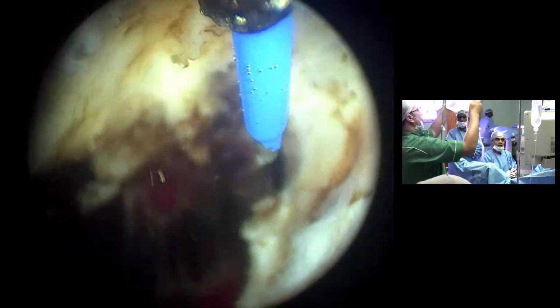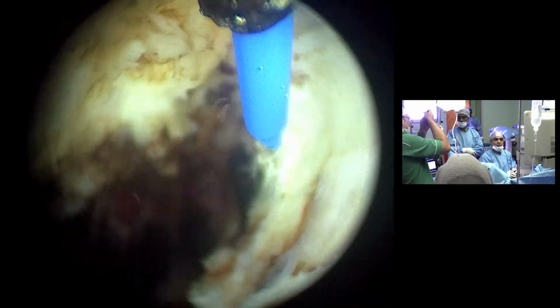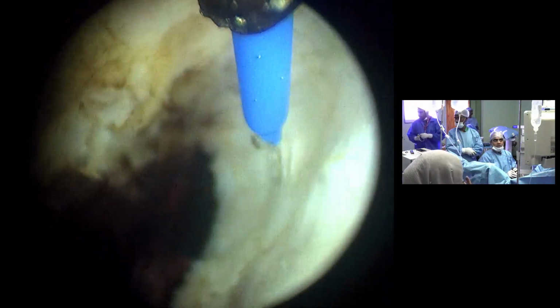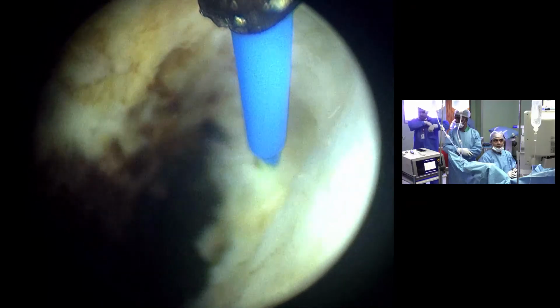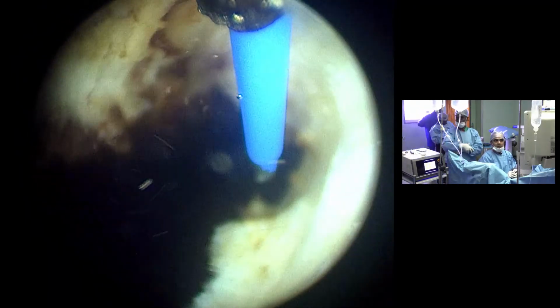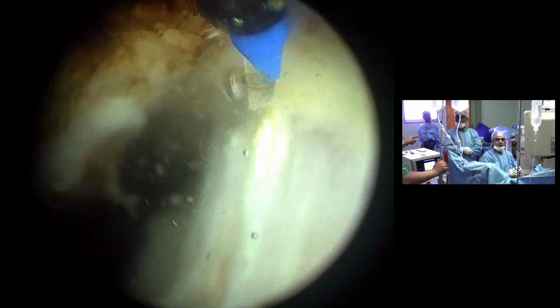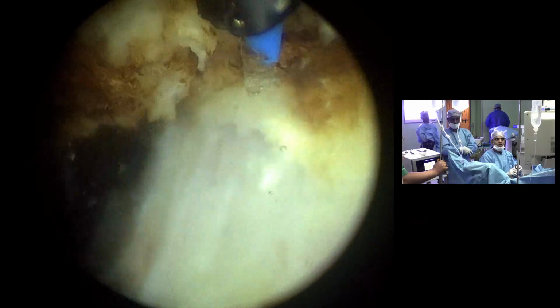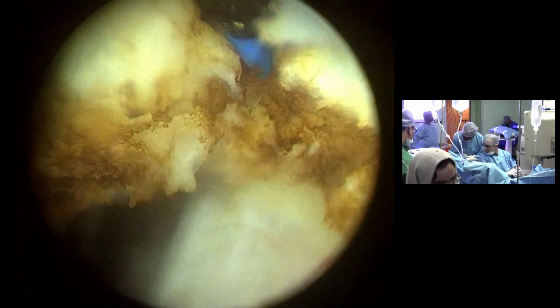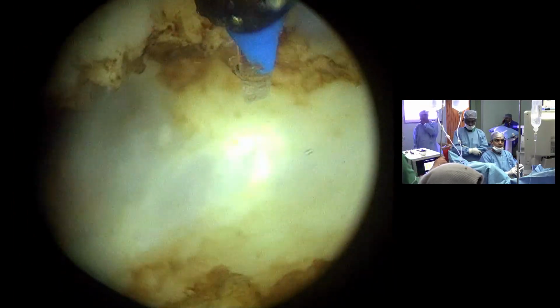The other thing is the irrigation. Sometimes people are too engrossed in the surgery, so they may forget that the bottle is empty. You have to look at whether there is an inflow or not. So if there is bleeding, first of all see whether the irrigation is there or not, and once it is there, then in Holmium you can defocus. In this you can just have a setting. So I have a setting of 0.2 joules and 150, so that's 30 watt for the coagulation.